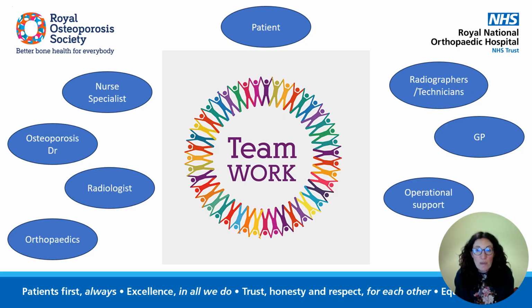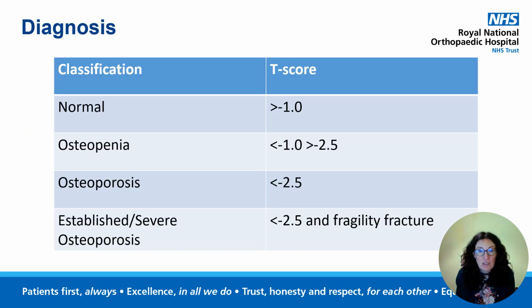So there's a lot of people who input into this, and when I'm teaching our radiographers locally, I really try to impress on them that what they do with the DXA scan is absolutely essential and pivotal to what treatment decisions I'm going to make and the discussions I'll have with the patient. So I'm just going to go through the different ways that I'm using the DXA scan and the report when I'm seeing patients. The first one's really obvious.